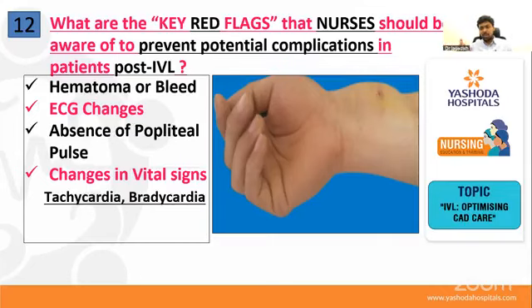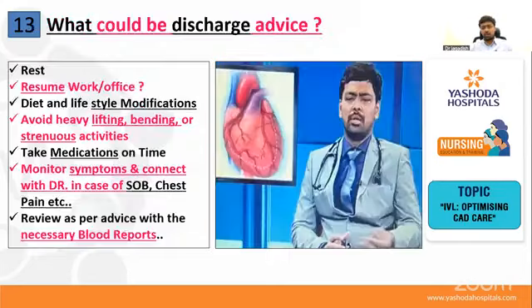Mainly the local complications like the hematoma, the sheath removal, and secondly, post-operative management: giving heparin injections, nicorandil infusion, and starting IV fluids to prevent contrast-induced nephropathy. So, 4 hours before the IVL procedure, during the procedure, which will take around 1 hour, and 12 hours after the procedure, these are very important phases. The post-operative phase has to be very meticulously taken care of, and I should congratulate all our people for doing it with great care.